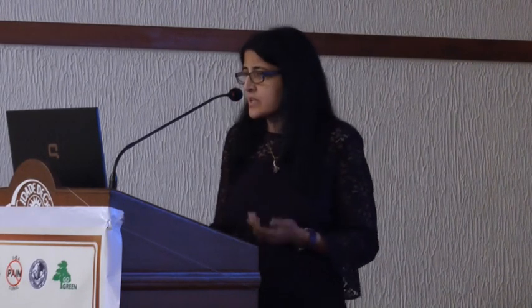Needling, again, in plane, out of plane. Again, the same principles. I prefer the in plane approach because you can see the whole needle as you are doing the block. Make sure you have the local anesthetic spread all around the plexus on either side and in between the nerve roots.